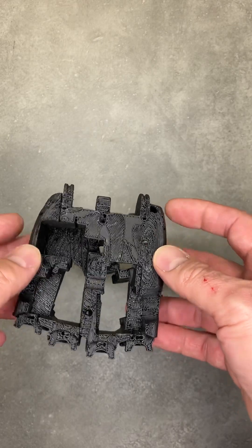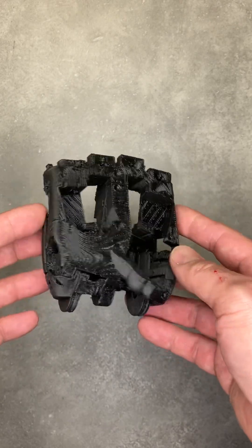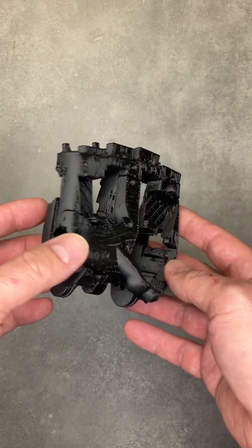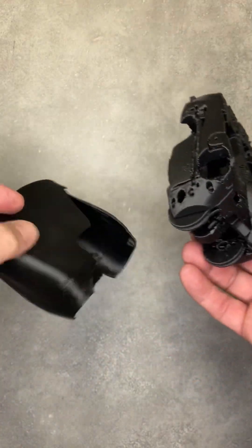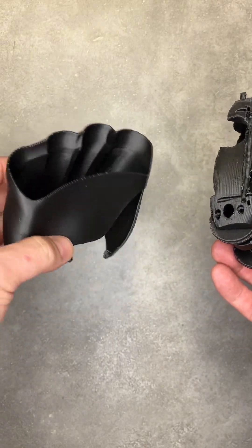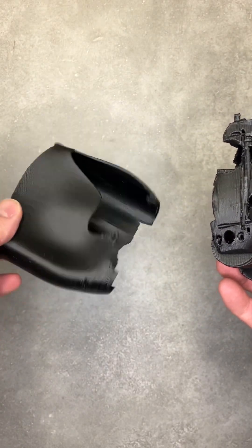I think there's enough clearance for wiring and I think all the tendons clear. Won't find out until I fully assemble it, and then I still have to work out exactly how the shell fits.